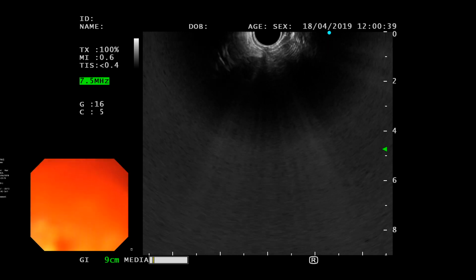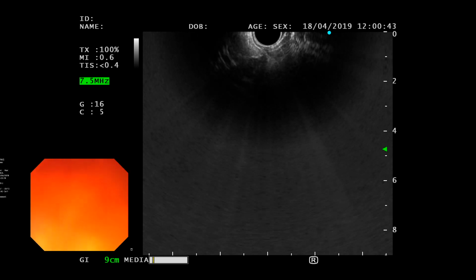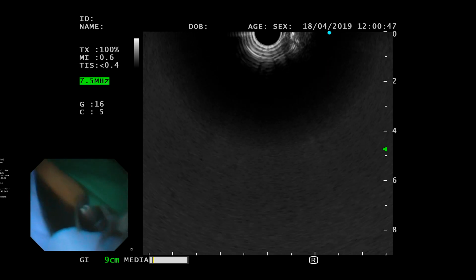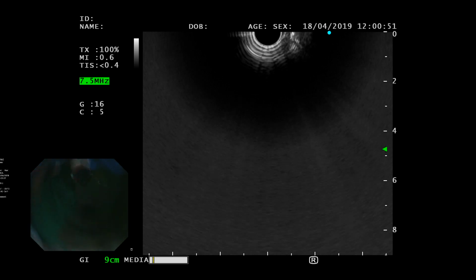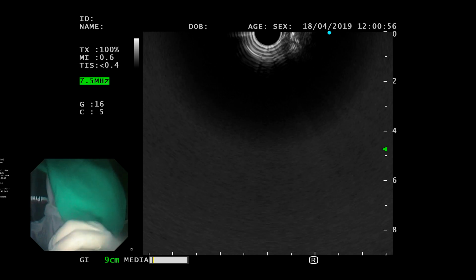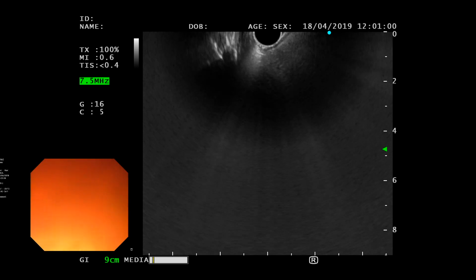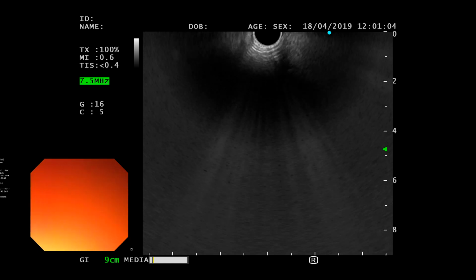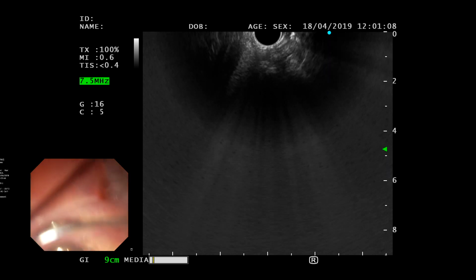Is it going easily or not? No. Okay. Let me just see one second here. So again, just like ERCP. I have it about this much. Okay, so get over the slide bend, get over the tongue. So here now I'm hitting the back of the tongue, so I have to thumb down even more. Okay. Now I'm over the tongue. I relax my big wheel and I advance.